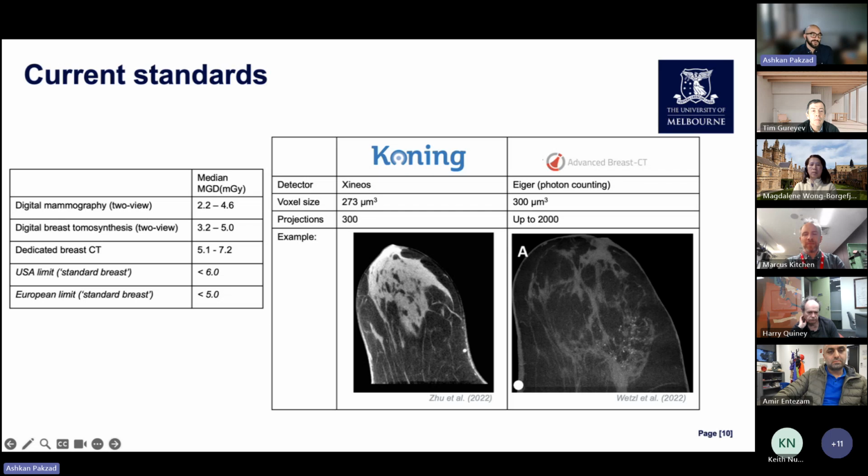Ultimately in testing, we were interested in using 4,800 projections for the 4 milligray image. So it's two different acquisitions for what we trained and what we evaluated on. Good, thank you. Thanks.